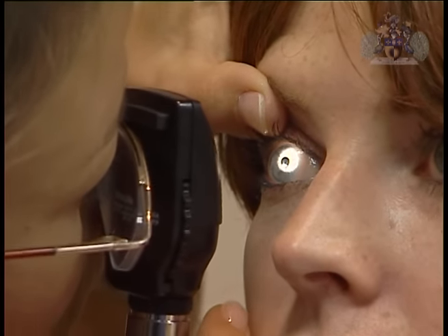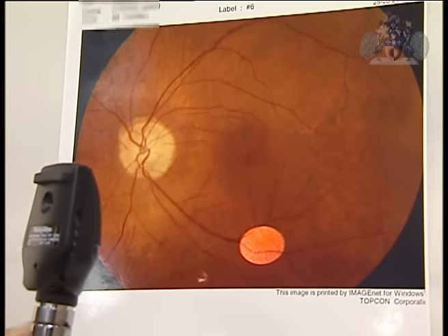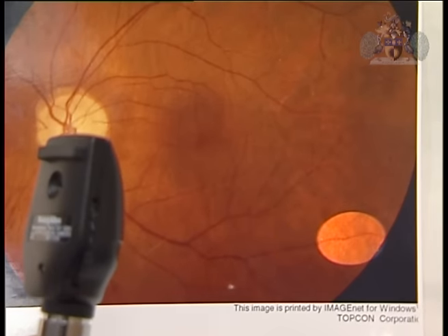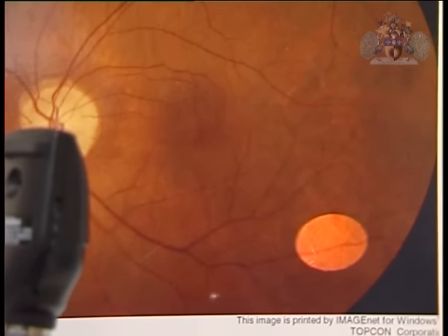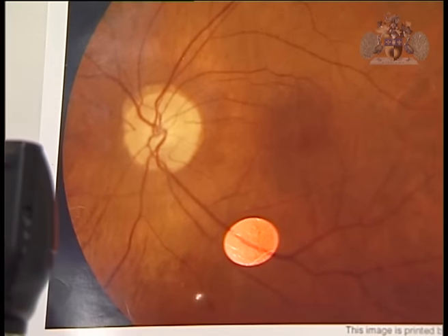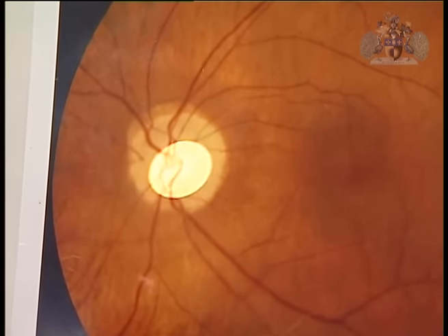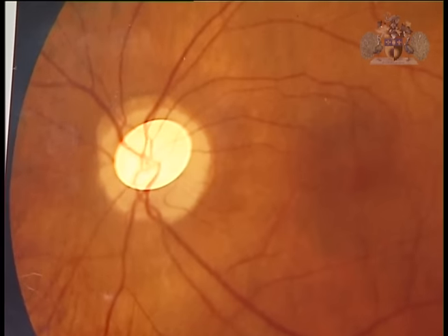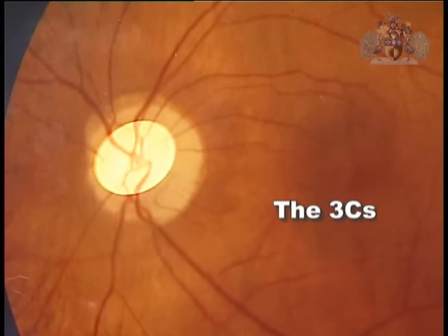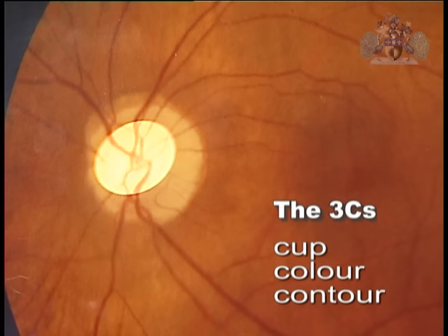Find a blood vessel and follow it — all blood vessels lead to the optic disc. If you have followed a vessel and not found the disc, go back in the other direction. Find the optic disc, which is nasal. Once you have found it, describe three things about the disc — the three C's: cup, colour, and contour.